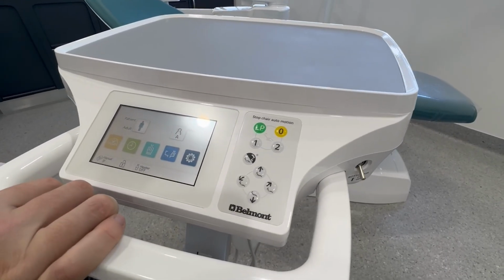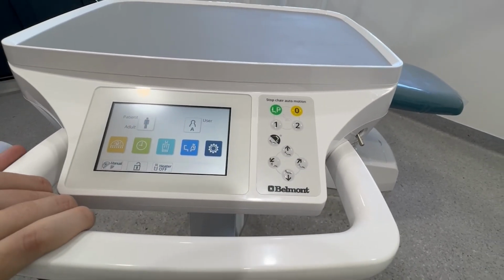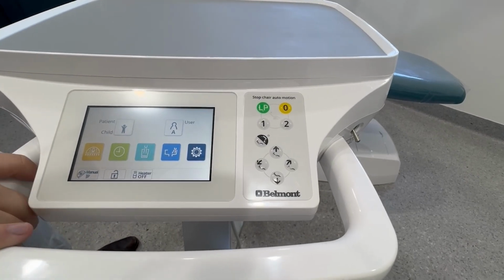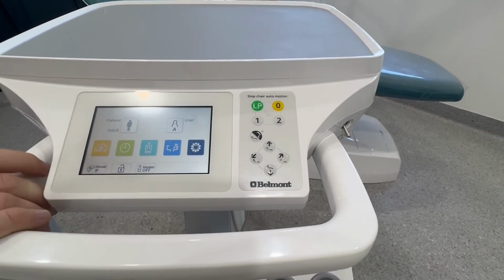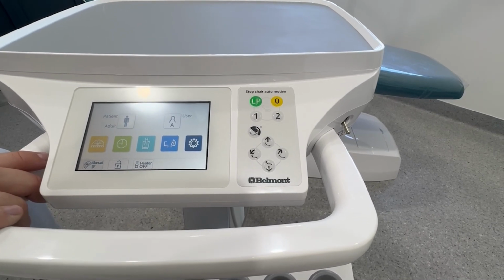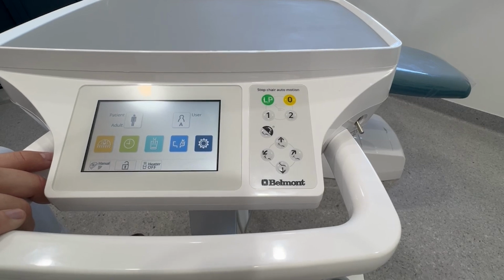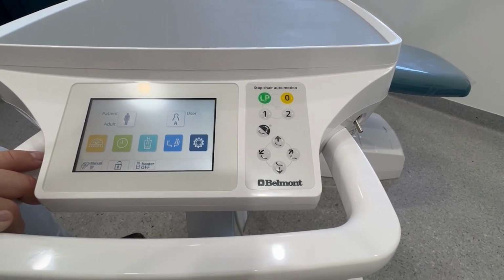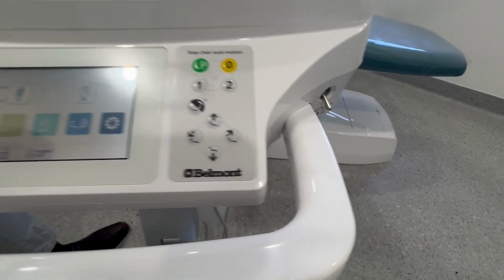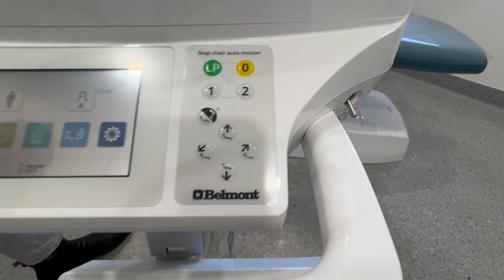Okay, now we're going to move on to the top row. So you see we've got patient there. We've got 3 different options on that. If we have a look, you'll see adult, elderly, and child. Now, you might have specific settings that you use for children that are different than elderly, for entry, exit, for presets. So you can actually have different settings for each one of those different patients. That gives you a whole lot more presets you can lock in there, which changes all of those buttons to have different presets, 3 times the number.